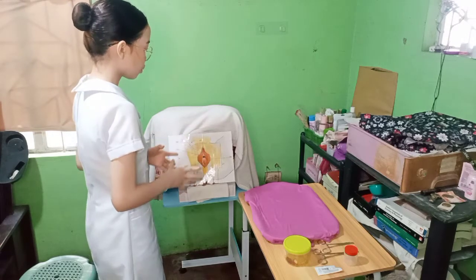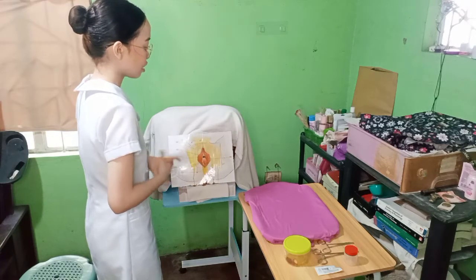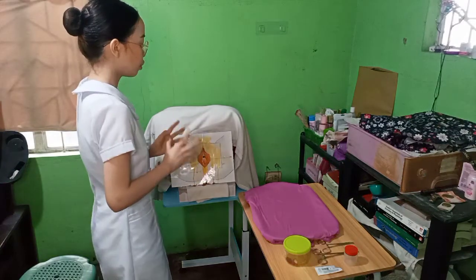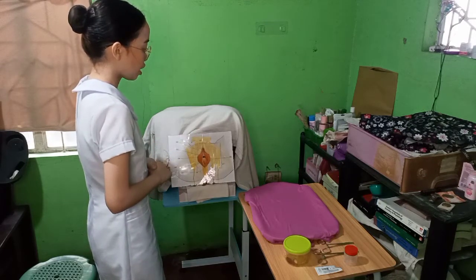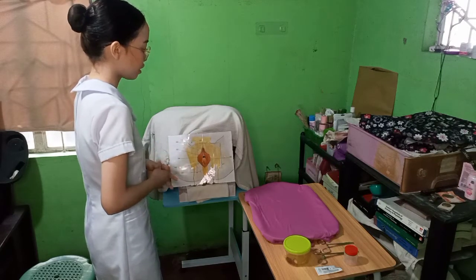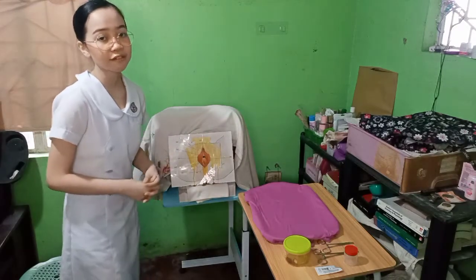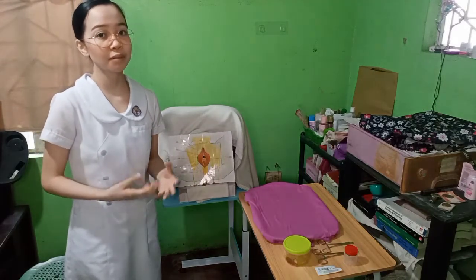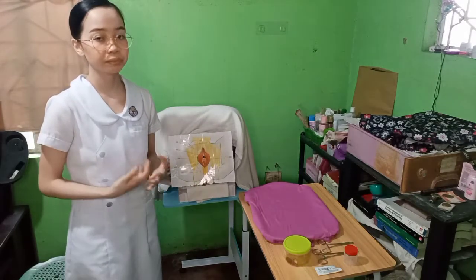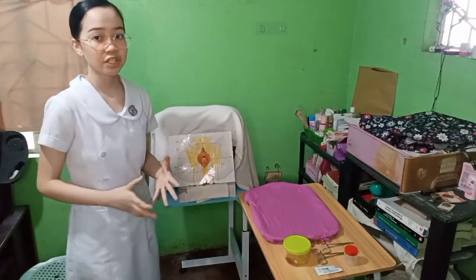So through inspection, there is no skin redness, breakdowns, or excoriation, as well as abnormal discharges. There is no visible swollen areas, and the urinary orifice is intact, and that is considered a normal finding. If there are any abnormalities observed, note them. And also note any untoward patient response.